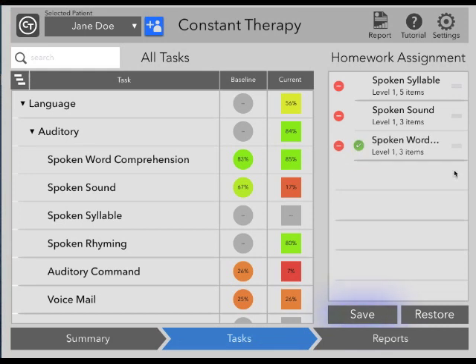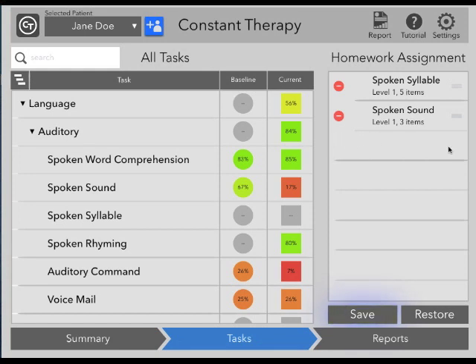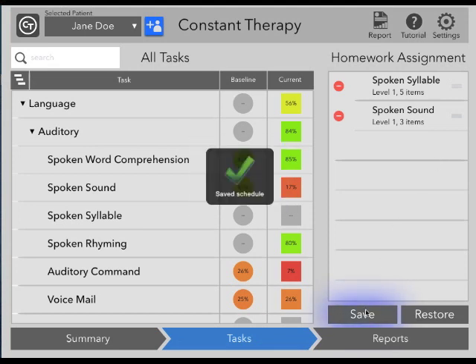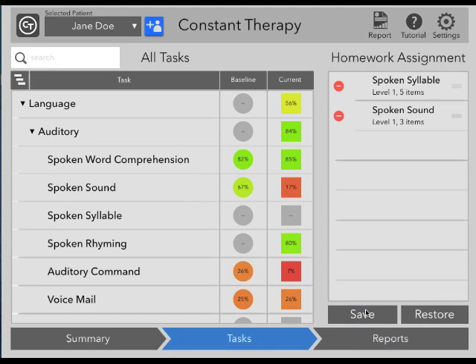If you need to delete an item, you can tap the minus sign and then tap Delete. It's important to note that every homework assignment must be saved. Use the Save button to save any changes that you make to the homework assignment. If you don't tap Save, any updates that you make will not be assigned to the patient. However, if you make a mistake and need to restore a homework assignment, you can use the Restore button. This will restore the homework assignment to the last version that you saved.